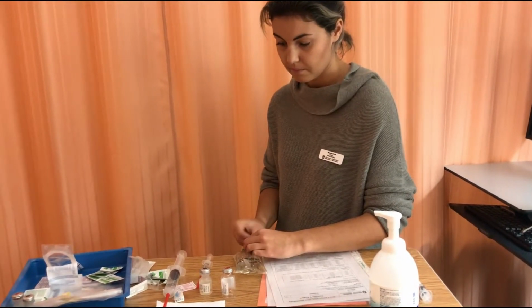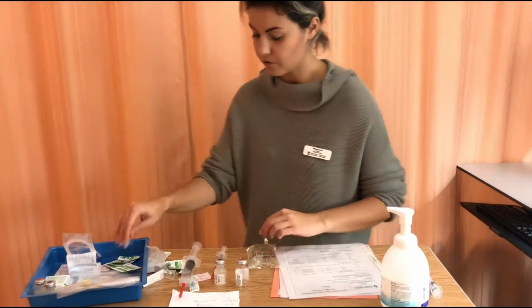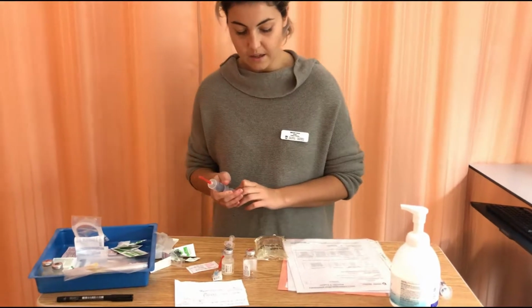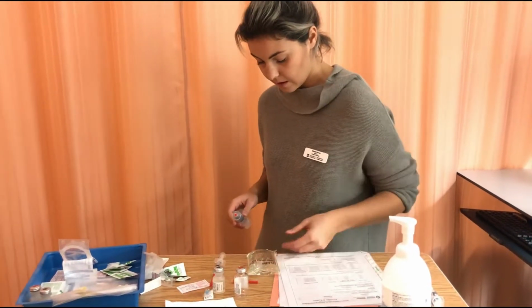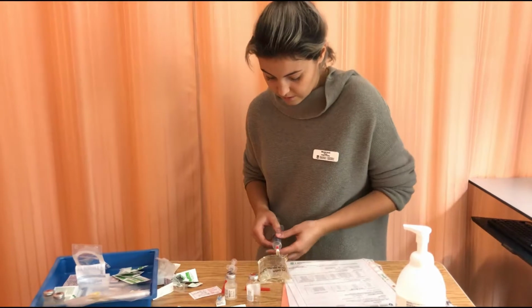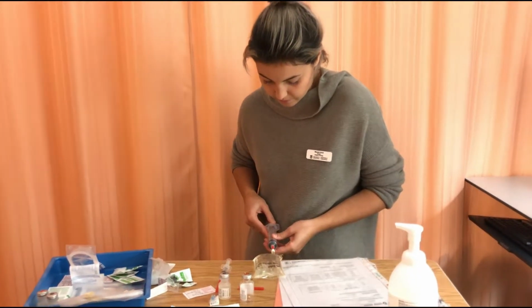So to begin with, I'm going to reconstitute this medication. According to my monograph, swab for 30 seconds again, and then let dry for 15. I'm letting the IV bag hang off the edge there, so I know that it maintains the sterility and the integrity isn't compromised at all either. So I'm removing the tabs. Now I'm going to enter the patient's room, using the safety check, swabbing for 30 seconds.